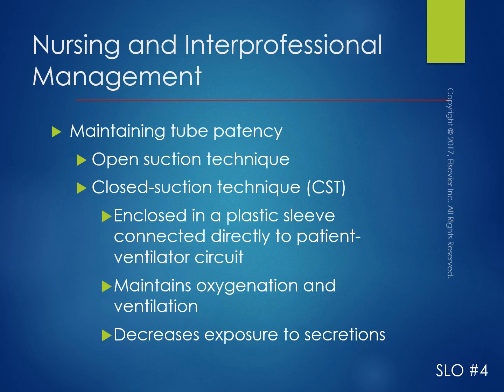What's nice about this is that it's sterile in an enclosed plastic sleeve, and it's connected directly to the patient's ventilator circuit, meaning it's connected to that tubing and stays connected to that tubing. The other end of it is hooked up to a suction canister, which is always on, because the catheter itself has an on-off, it's not really a button or a switch.